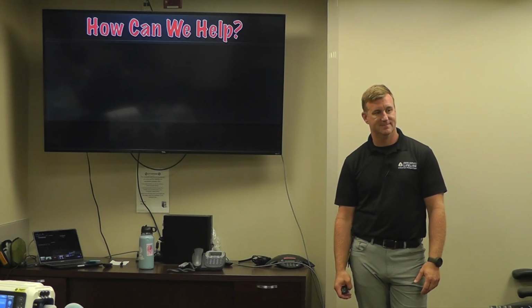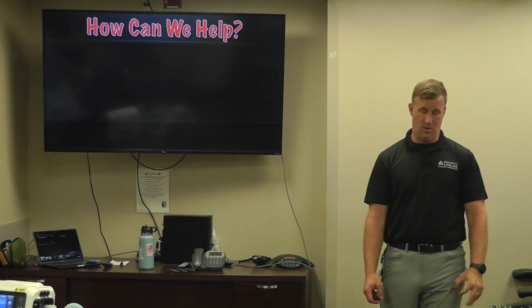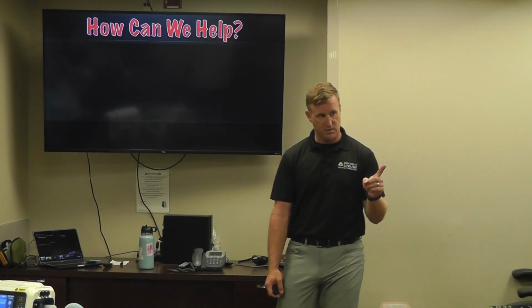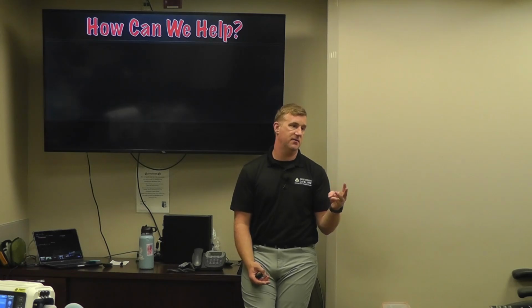It keeps the alveoli open in the patient's lungs. It's not giving them breaths, but it's more like assisting them when they take them. To some extent, you're right. You're 100% right. So it's a single pressure. So do you know what CPAP stands for? Continuous positive airway pressure, right?